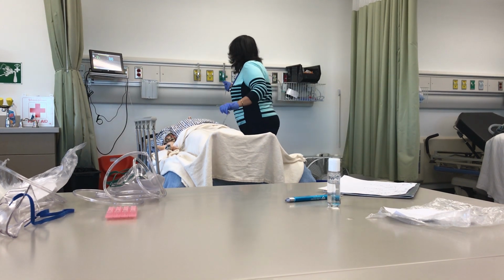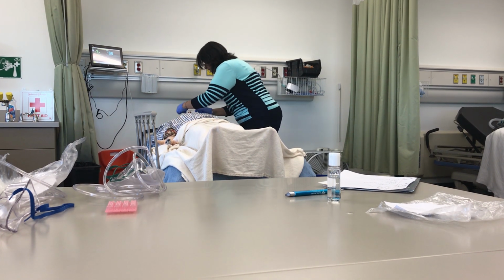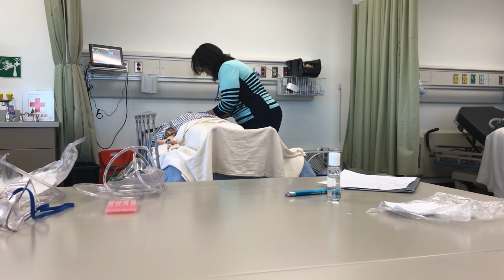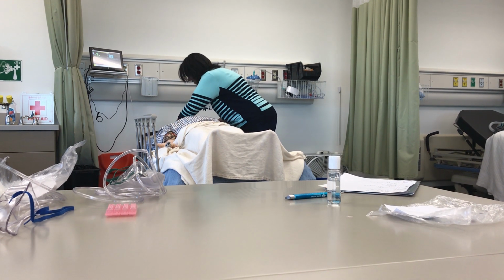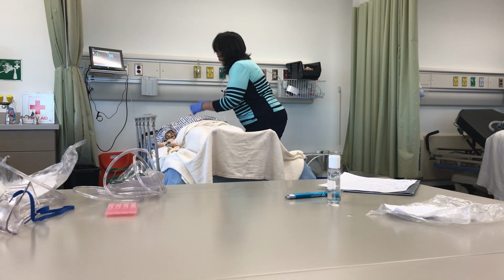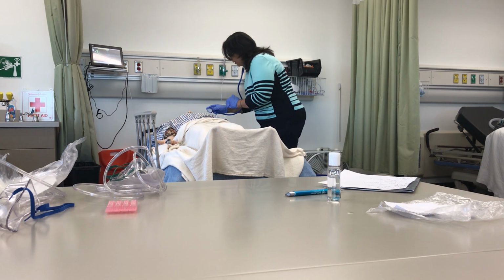I'm gonna put you on some supplemental oxygen. Little nasal cannula right here. I'm gonna put this on your nose for now and see. Oh, that feels a little tickly. I know, the oxygen can be really dry. I'm gonna put this in your nose, and try to take some nice deep breaths for me. I know. I'm sorry you're not feeling well. So in the meantime, I'm gonna listen to your breathing and hopefully your SATs will pop up.